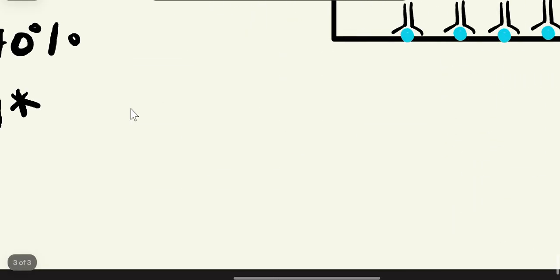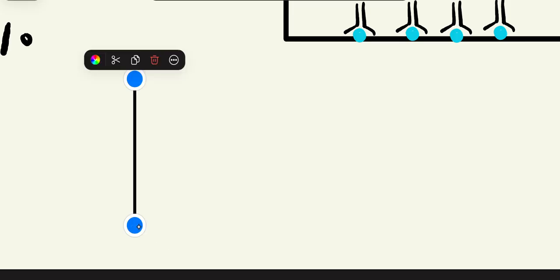So now let us plot the graph for the same. If we need to plot the graph, this will be our y-axis, similarly this will be our x-axis, and then we are going to plot it. Suppose we are plotting it with green color.